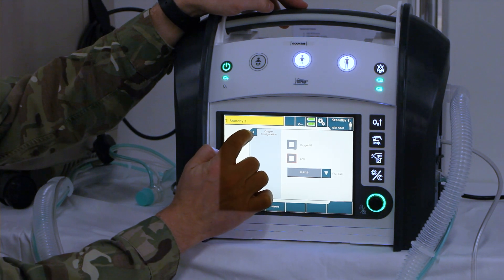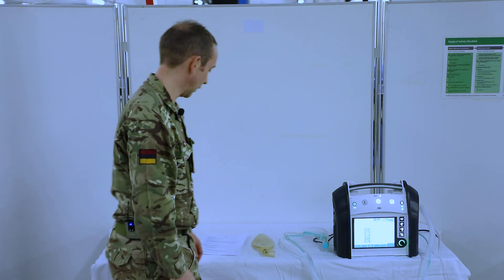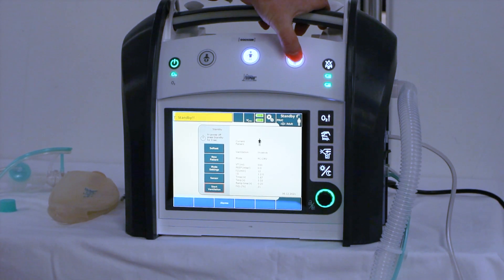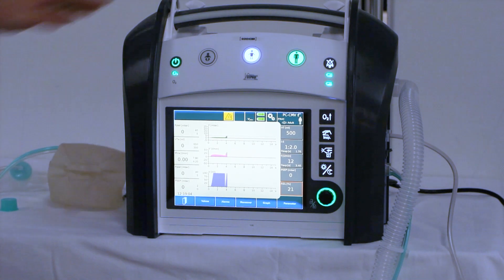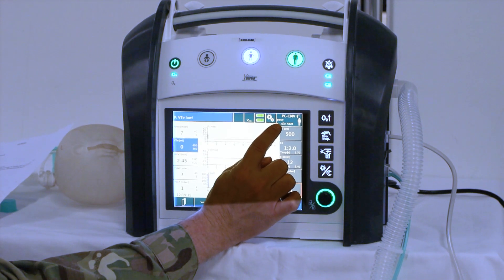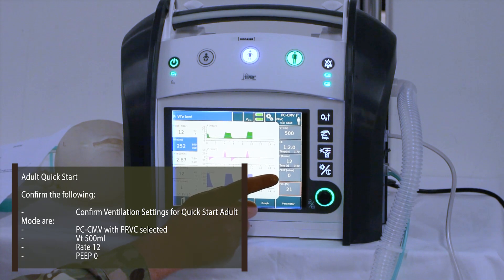Once you've confirmed that both are deselected, cross out, cross out again, cross out again, so you're back to the home screen. Once we've checked the oxygen configuration, we're then going to attach our test lung to the ventilator and press the adult quick start button — press once until it flashes green and press again to confirm start ventilation. We should have pressure control, controlled mandatory ventilation with pressure regulated volume control selected, a tidal volume of 500, a frequency of 12, and a PEEP of zero.